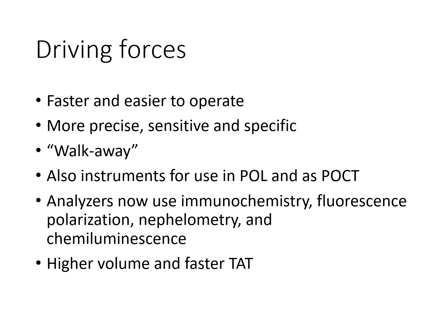For modern clinical analyzers, we are always looking for something better, right? So faster and easier to operate than before, of course, improved precision, sensitivity, and specificity. We like the option of a walk-away capability, so automated operation without having someone to constantly do the next step. Instruments available for point-of-care testing. Techniques that have been incorporated include immunochemistry, fluorescence, polarization, nephelometry, and chemiluminescence. These have been designed for higher sample volume and faster turnaround times.